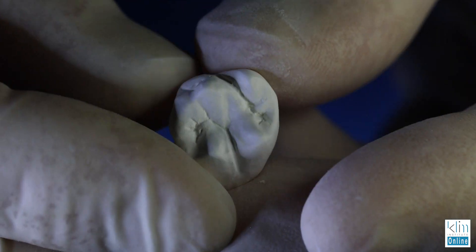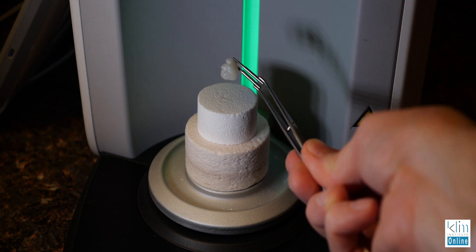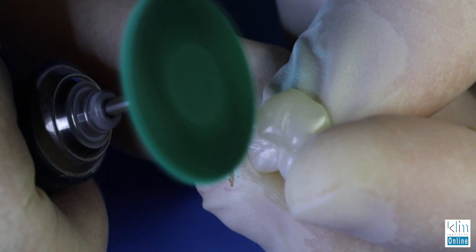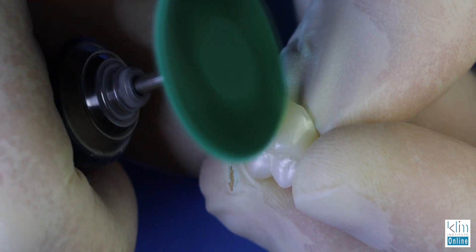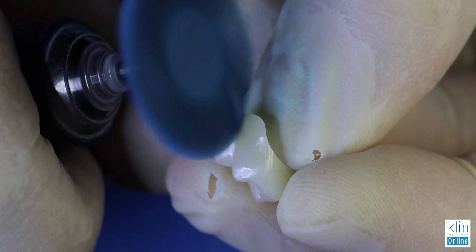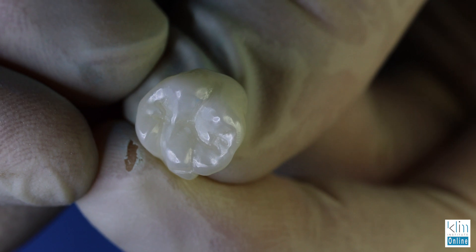Those pink and beige polishing wheels create a really nice pre-sintering luster, so when it comes out of the Speed Fire it's really easy to finish. All we do is use the green wheel to polish the margins, use the green twist, then polish up to the blue twist, and then use a diamond paste. I'll fit it in the mouth, make sure the proximal contact is spot-on, then check the occlusion and make any minor adjustments with a polish.